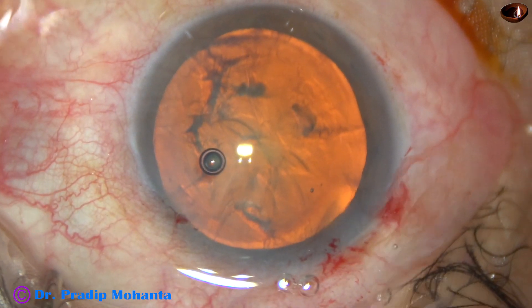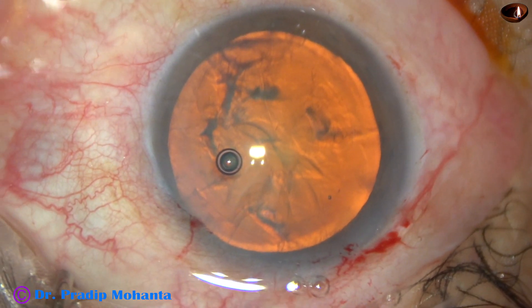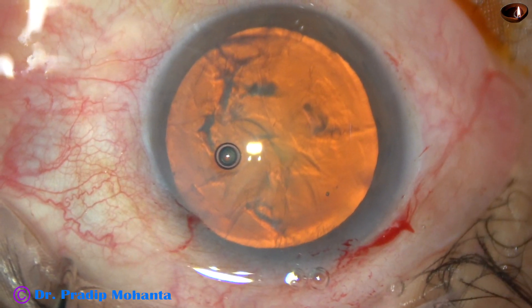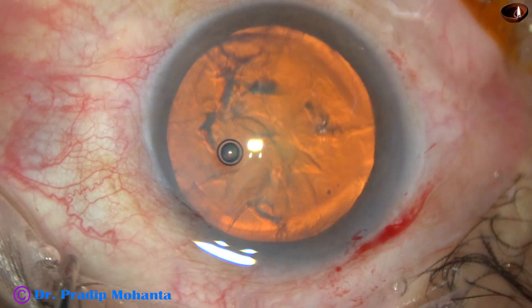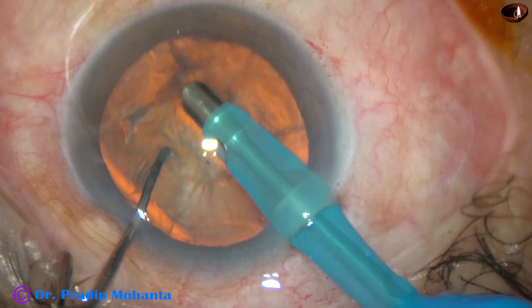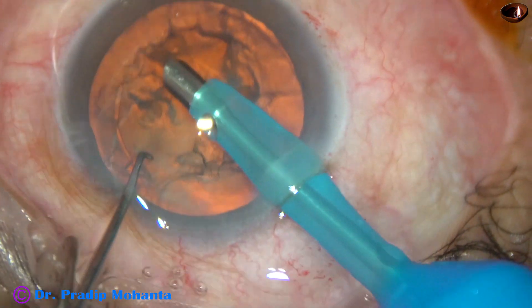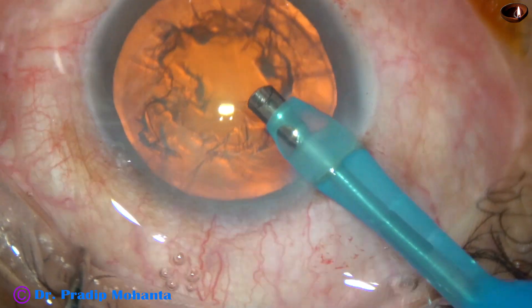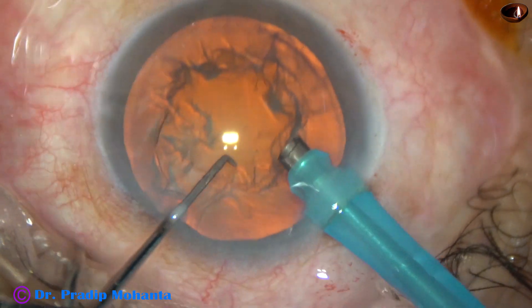Now some more visco, and now is the time to introduce the tip of the FACO needle. The machine being used is Alcon Infiniti with OZIL mode from Alcon, Switzerland. The tip goes into the anterior chamber. Some superficial cortical lens matter is removed in a bevel-down position. Now the handpiece is turned and the bevel is off.